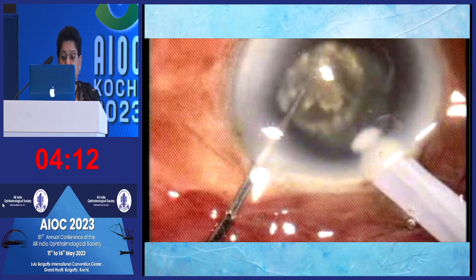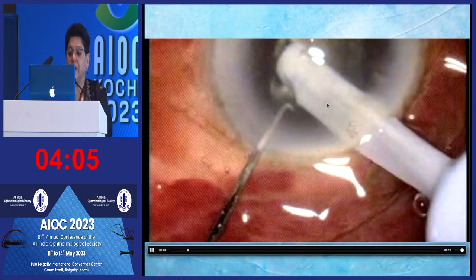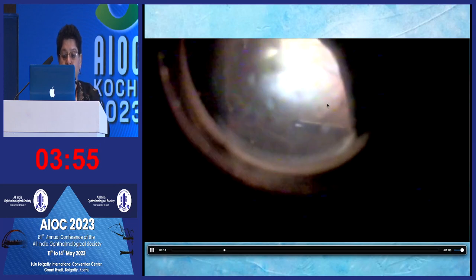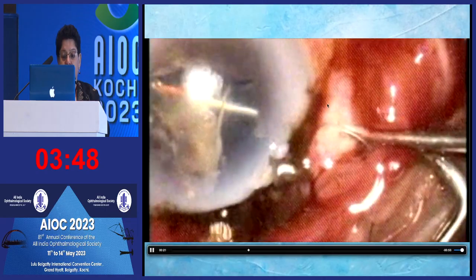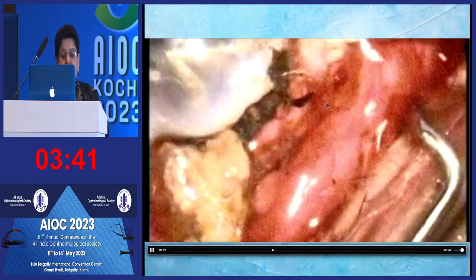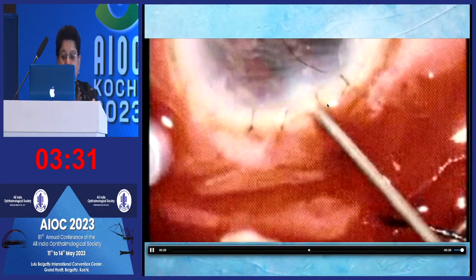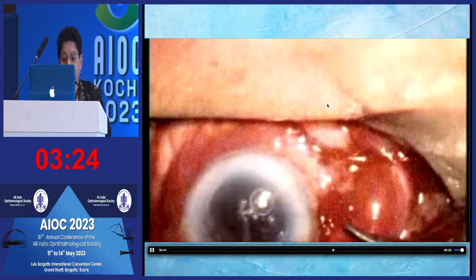So this is the surgery of the patient. The hard nucleus had a drop into the vitreous cavity. The fragmatome was unable to cut it effectively, so a PFCL extraction was planned, and PFCL was put behind the nucleus, and it was removed through the limbus. As you see, there is a whole lot of rock-hard nuclear fragment coming out. And when we are stroking this in, you can see the bleed coming in. So that was the onset of the suprachoroidal bleed.